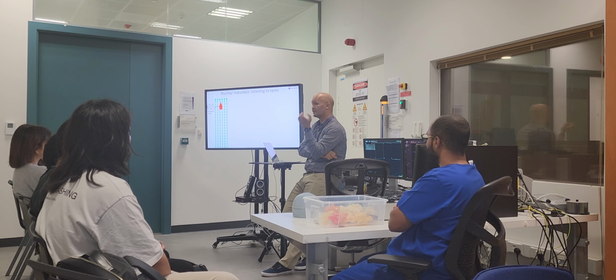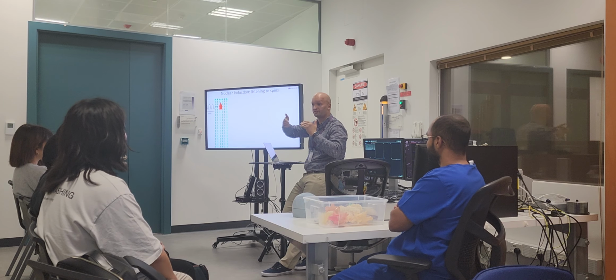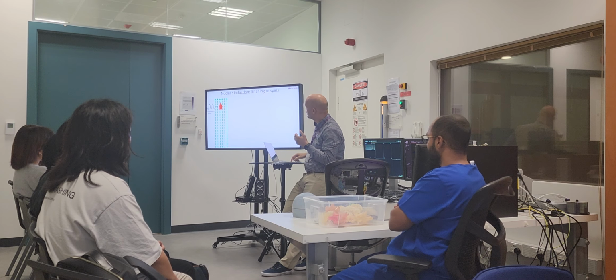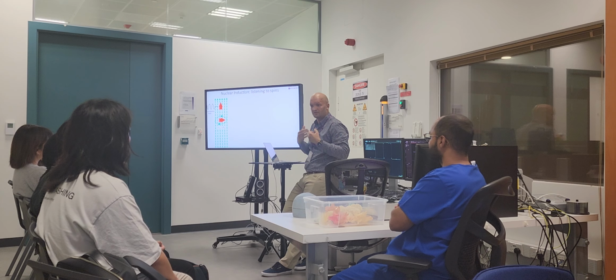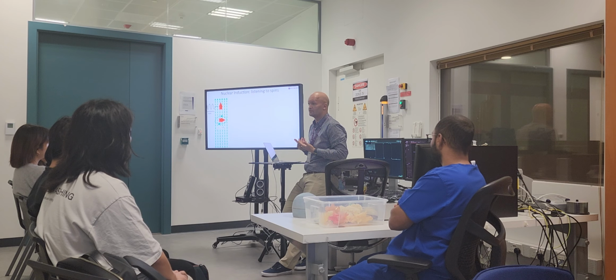And if you apply it on resonance, we always use the swing analogy. If you want to maximize your swing height, if you do small pushes at the right frequency of that swing, you will maximize your energy transfer, right? Similarly, the magnetization is going to take your energy if you apply it on resonance, and then it doesn't like it. It wants to come back to equilibrium.